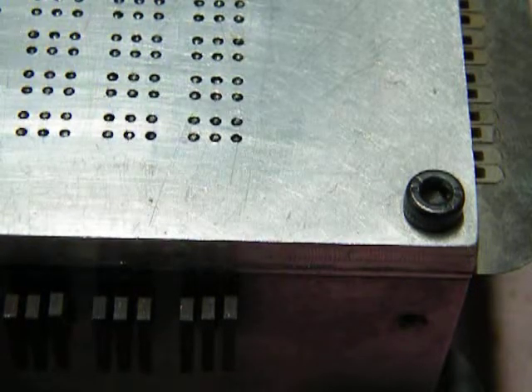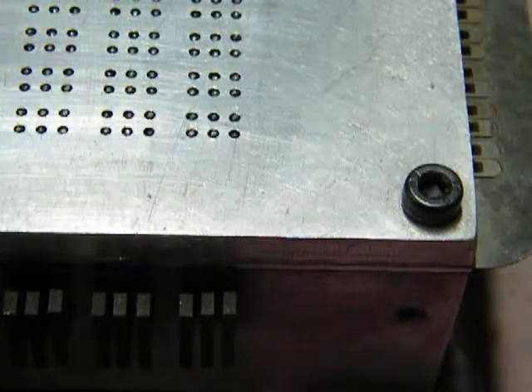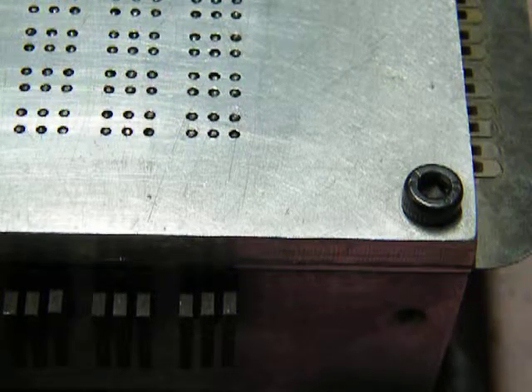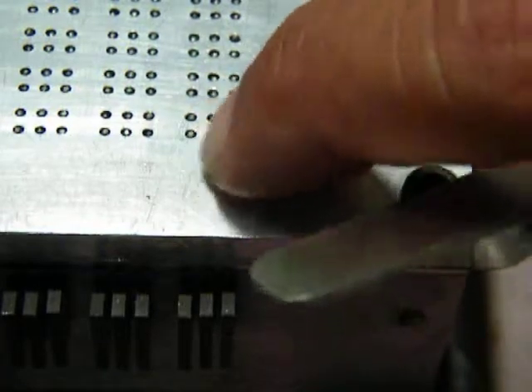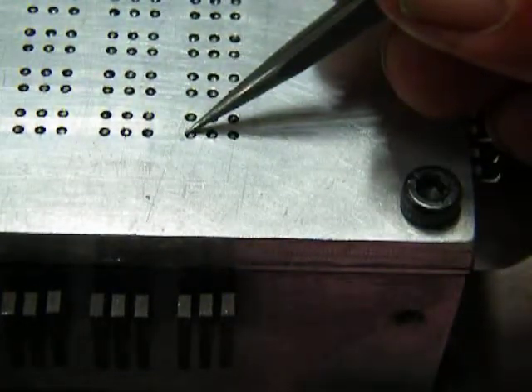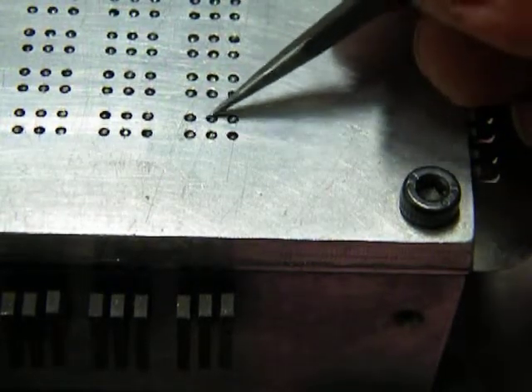Okay, in this video I'm going to show you how the rows and columns are used to control individual pins in each cell. I'm using the bottom half of the display over here. This is I think the fifth line, and I'll show it to you from the reverse. This is dot one of the fifth line, dot two, three, four, five, six.